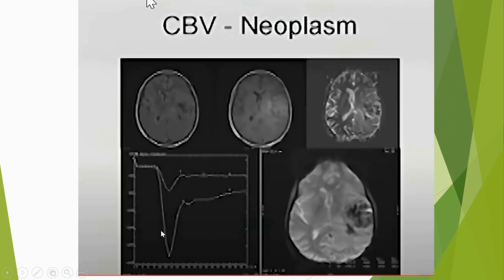Everything in this area has a specific management from a diagnostic perspective, whether it is transit time, or cerebral blood volume, or the time to peak.